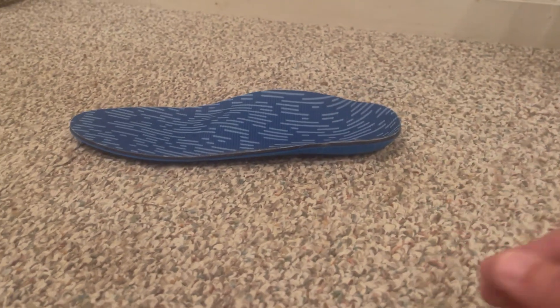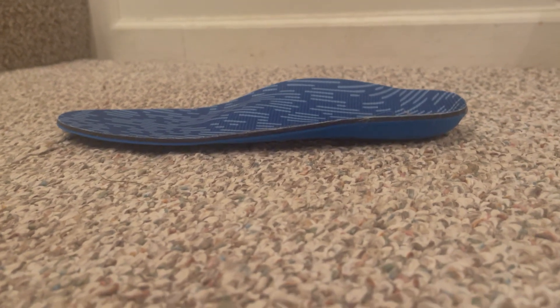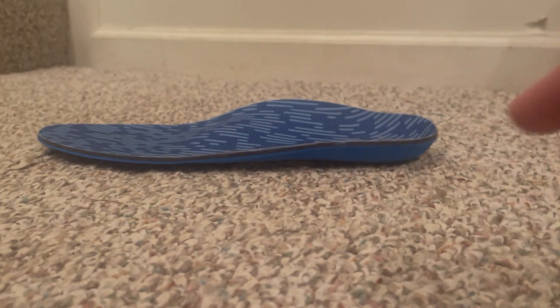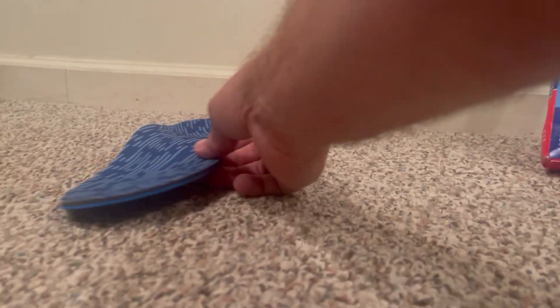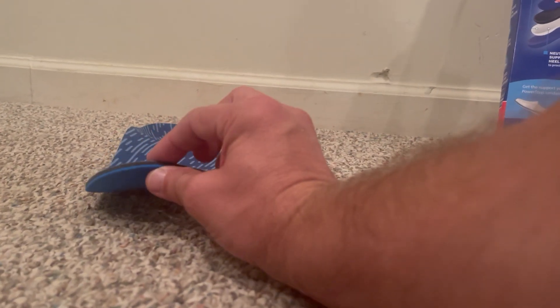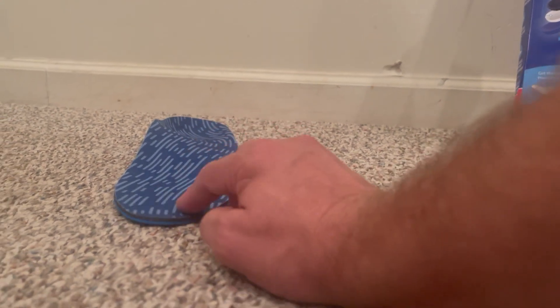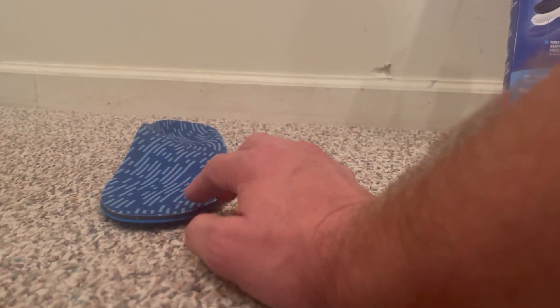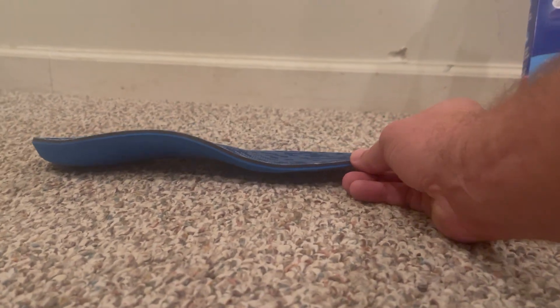I just want to help you see what it looks like from each direction. If you look at the side here, it's about a half an inch high and then it gradually goes down. Looking at it from the front, you can see it just naturally goes into your shoe — it's not that thick at all. It's very comfortable as it fits into your shoe, and looking at it from the side you can see more of the features.